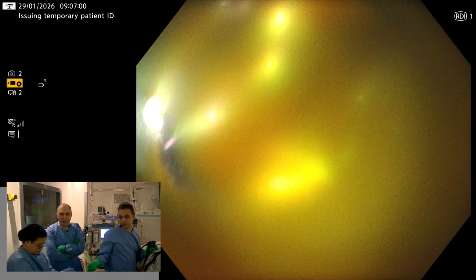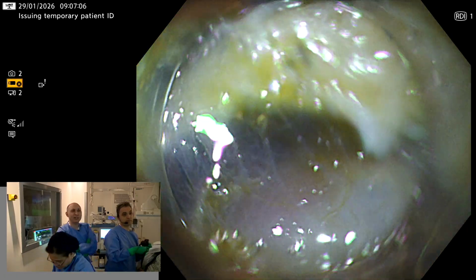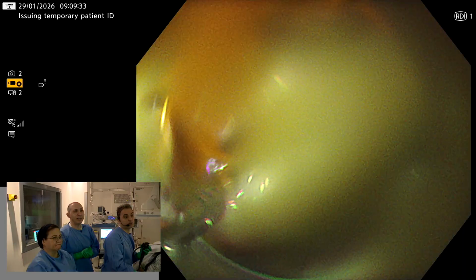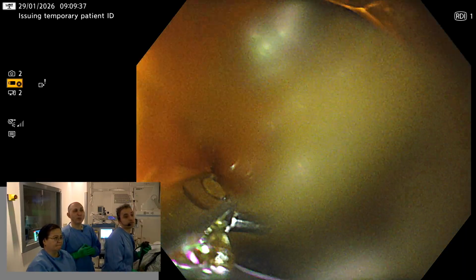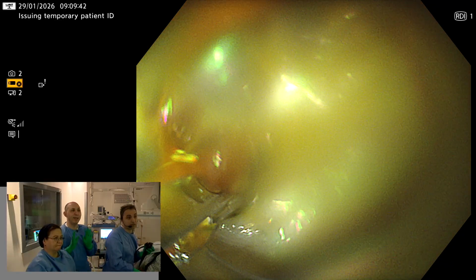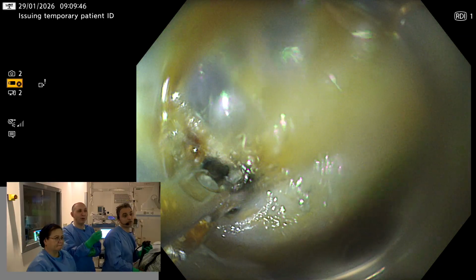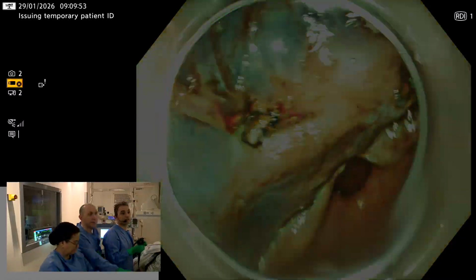Regarding the question of Dr. Noor, I'm glad to see you again here, my friend. The strategy here was some of the important things that we are facing in doing ESD. In ESD, we have to be competent dealing with bleeding and perforations. These are the two major things we have to keep in mind. As you see now, the bleeding is stopped and this is good hemostasis. Okay. Excellent. That's very well done.